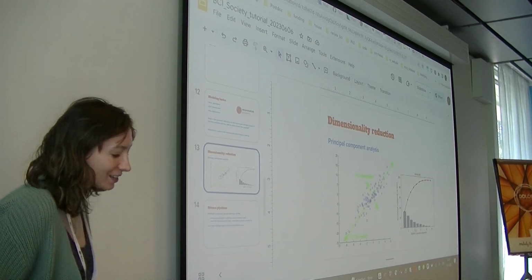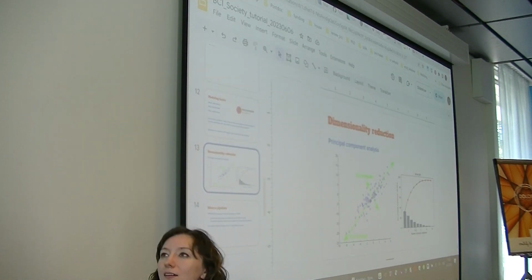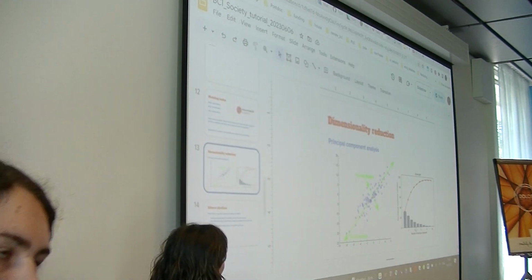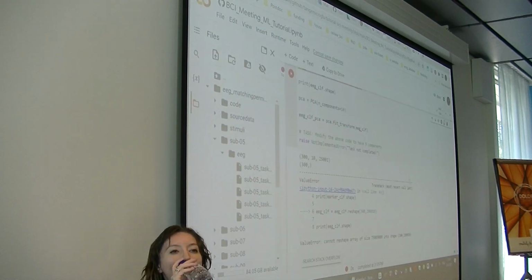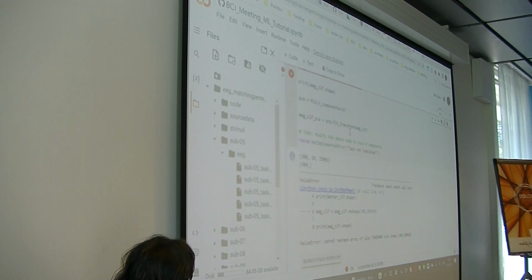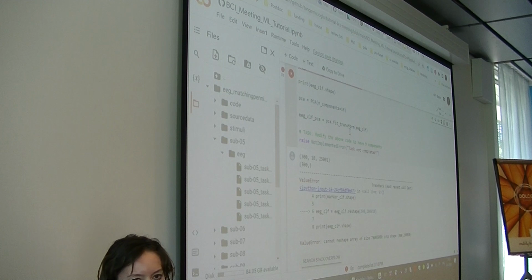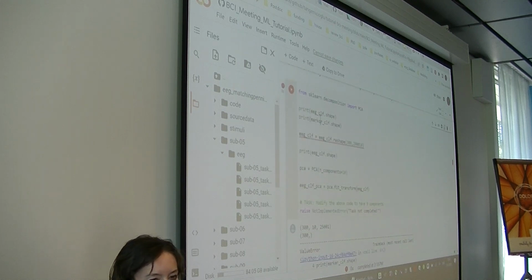And just as a bit of an extra, dimensionality reduction is typically considered an unsupervised learning method. And that's because to perform this, we aren't even going to be using our marker stream. We only need the original data. But there are a few methods that are supervised dimensionality reduction methods, like linear discriminant analysis. In my experience, they don't provide that much benefit because PCA and other methods like independent component analysis are already quite powerful.